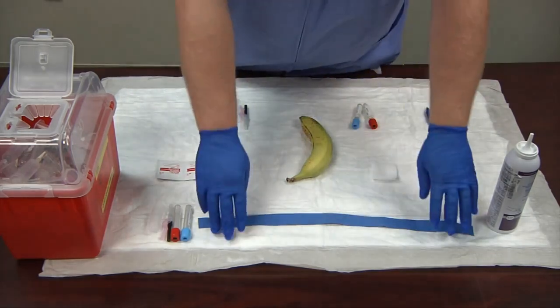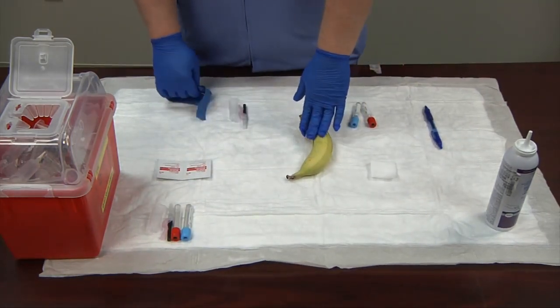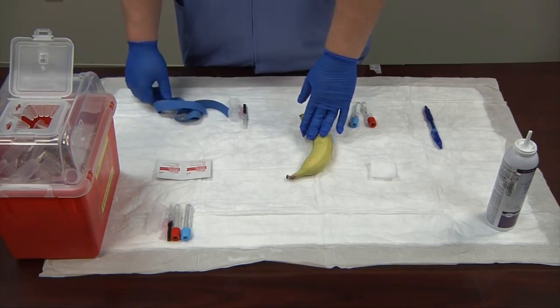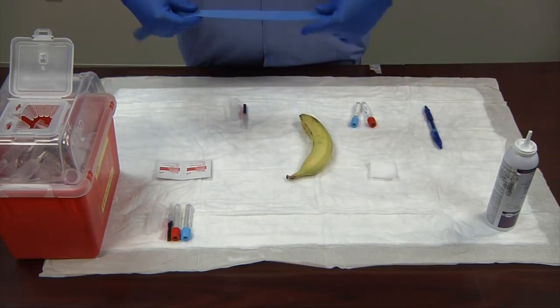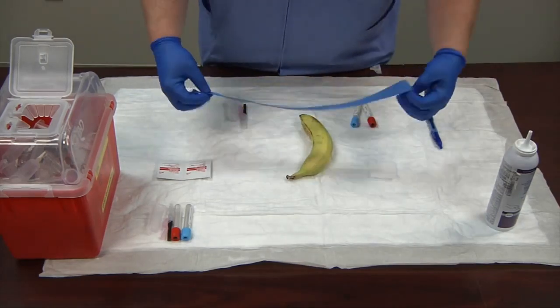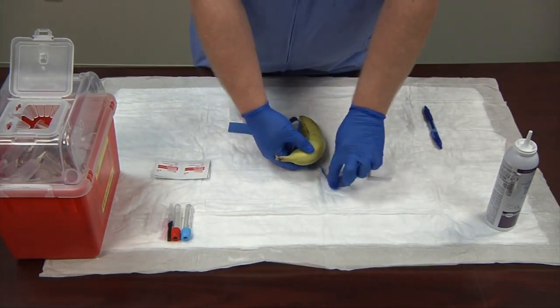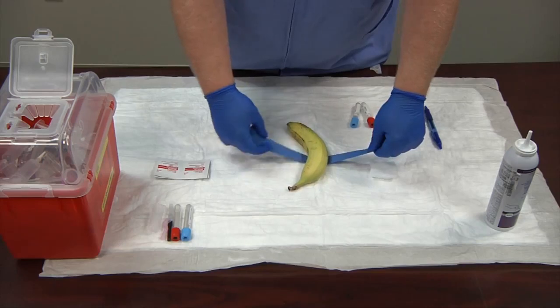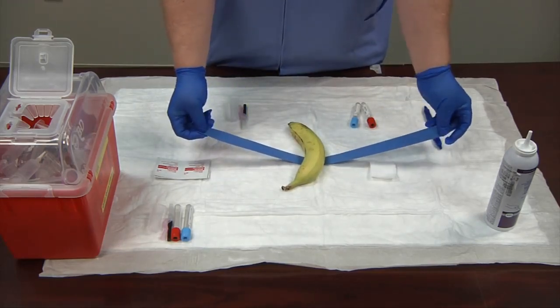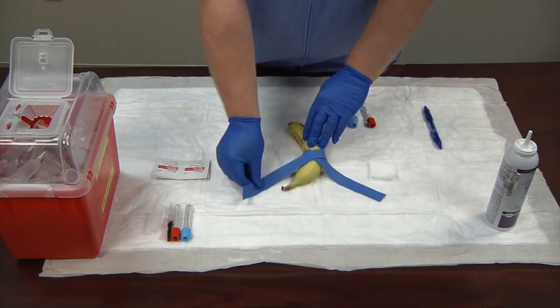Now I'm going to take my tourniquet — this is my pretend patient, Mr. Banana. I've already ID'd him and compared him to the requisition the doctor issued; the ID matches up. I have informed consent from the patient. I'm going to wrap the tourniquet around Mr. Banana. We won't be able to tie it all the way as the tourniquet would be too rough on the banana, so we'll simulate by just laying it over.